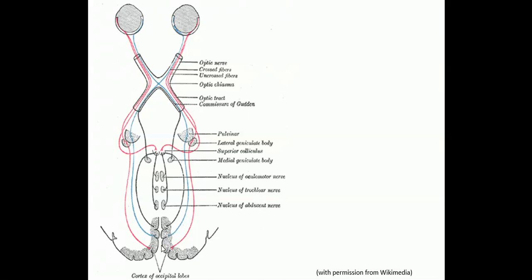Before we do, in terms of our orientation here, we want to think about as if we're looking from below. This is because in the standard MRI, if this were an MRI picture, what's on our left is the right side, and what's on our right is the left side. And that's a little bit confusing. The best way that I can think of to conceptualize it is picture that when you're looking at this picture, or in an MRI as you're running through it, that you are standing by the patient's feet. They're lying down in front of you. You're closest to their feet and looking up towards their head. And of course, if that was the case, then it makes sense that this would be their right side and this would be their left side.